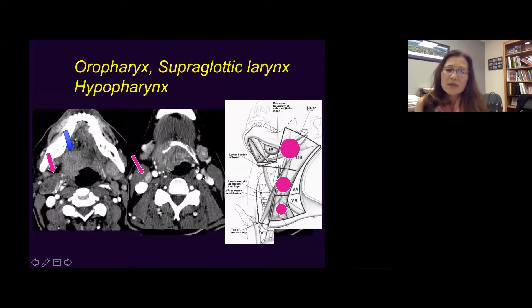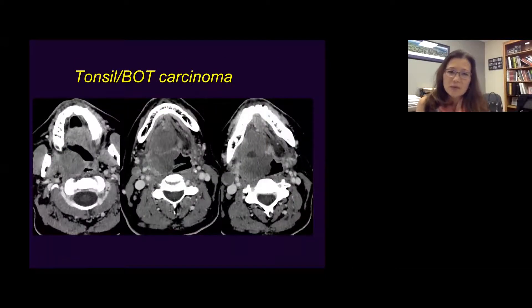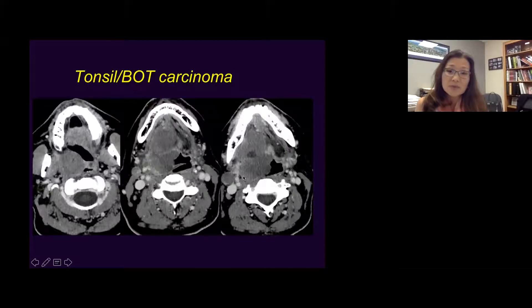This is another example of base of tongue and tonsil carcinoma — a very large primary tumor with very cystic nodal metastasis at level 2. Those are very predictable locations for oropharyngeal primaries.